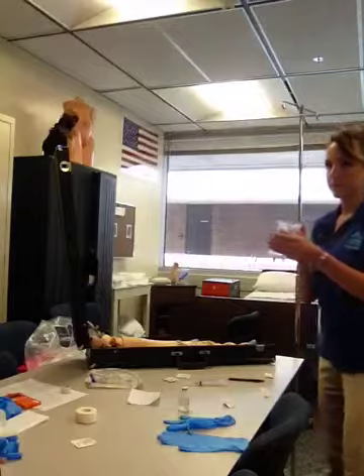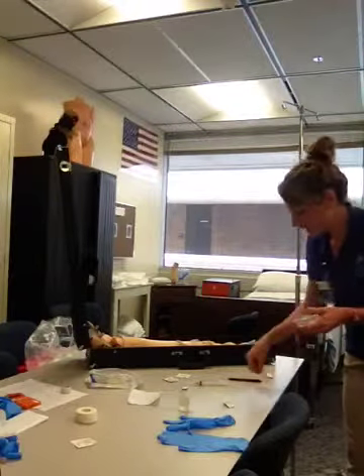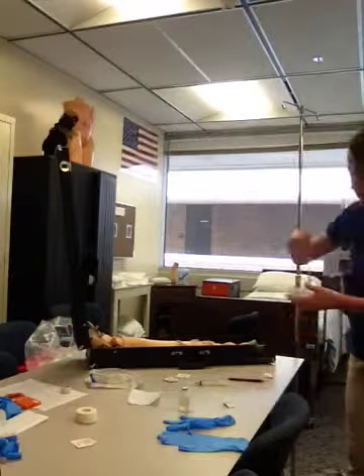To mix the solution, and I'm going to label the container with our client's name, the dosage, the drug Herceptin, the time, and my initials.